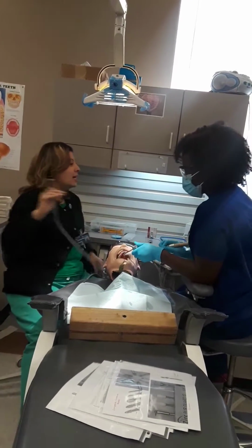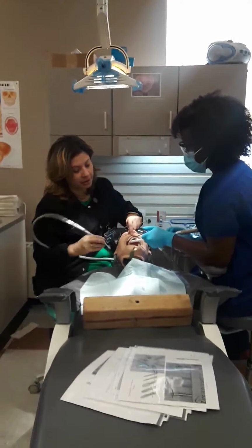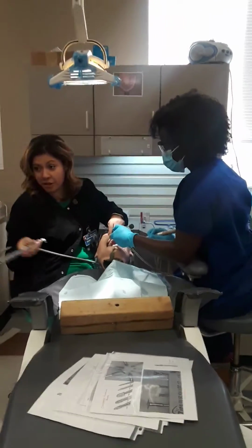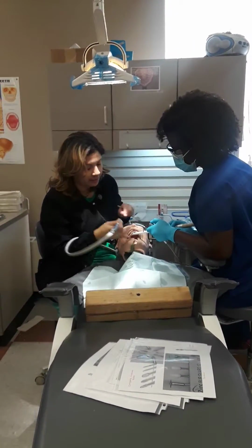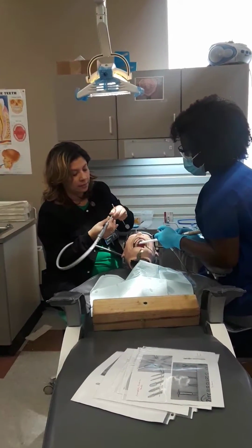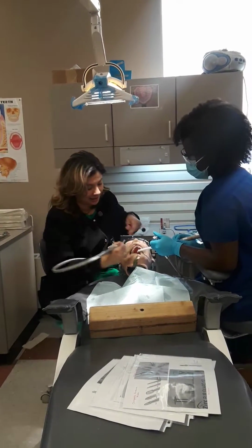Then I should be on what step? Slow speed. When I get my slow speed, that should be dry, that prep. So let's go ahead and burst some air. If it's not listed, add that to your procedure. Air, that was water. Oh, I needed air. Sorry. On slow speed. It should be locked, but there we go.